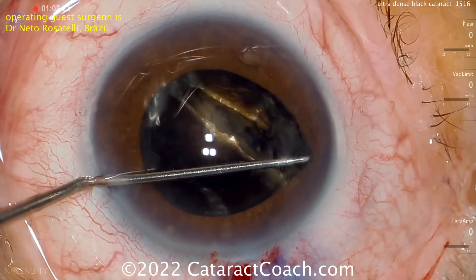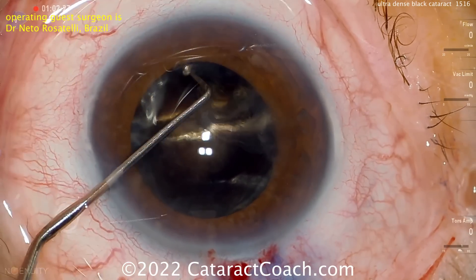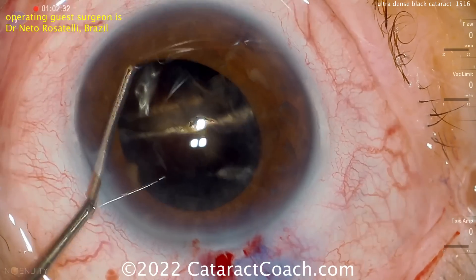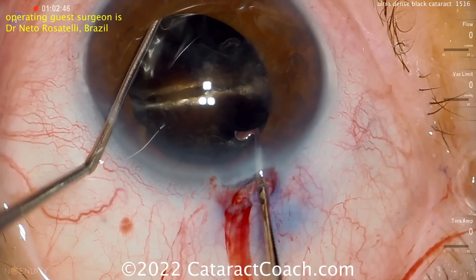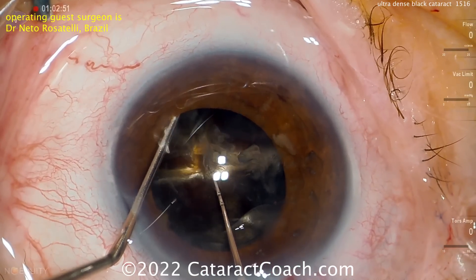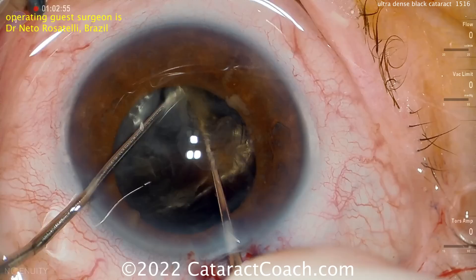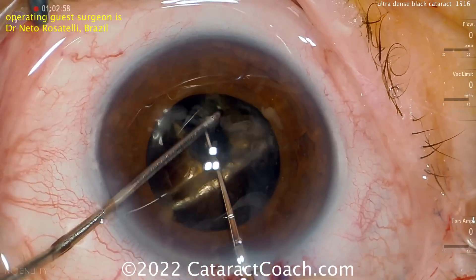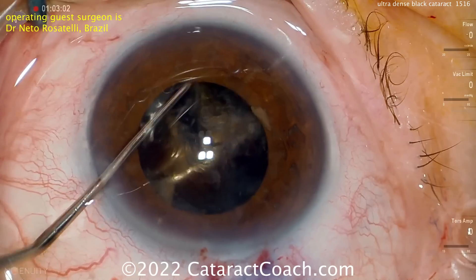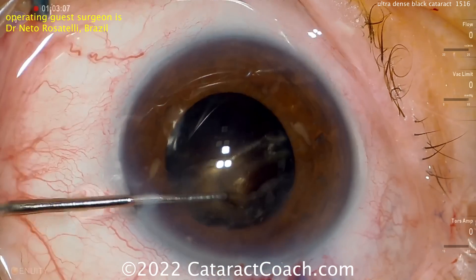Viscoelastic is your friend here — more viscoelastic going inside the eye. Look at just how absolutely opaque this lens is. Now rotated 90 degrees, this hook is going around the lens equator to hold the nucleus — it does not move. The sharp front edge of the chopper is pushed inwards and together, and that'll help split the nucleus. And pow — nicely done. These types of cataracts tend to be very dense and fibrous, almost leathery, and sometimes it's hard to even split them — that's why I like the idea behind this sharp chopper.